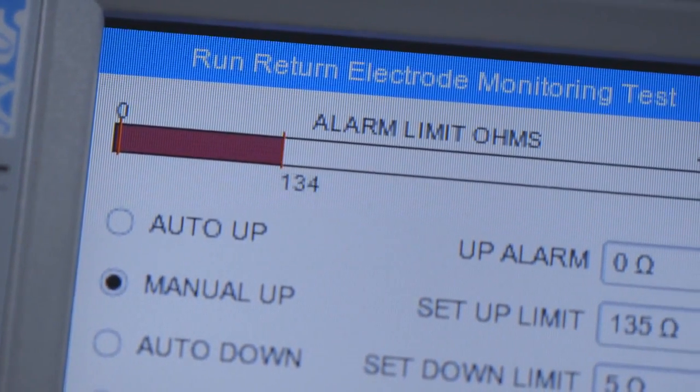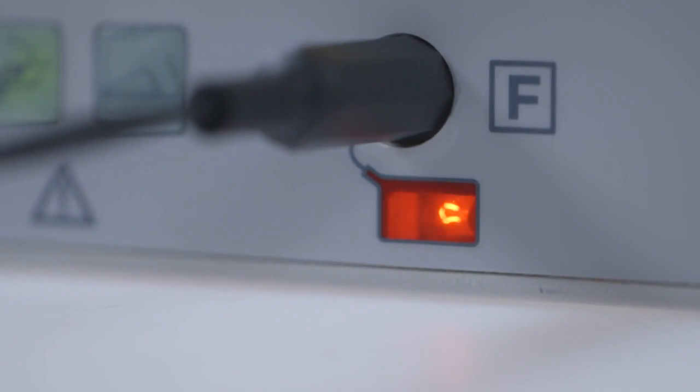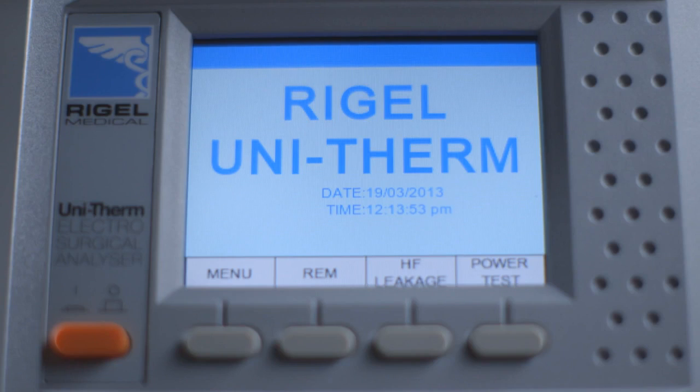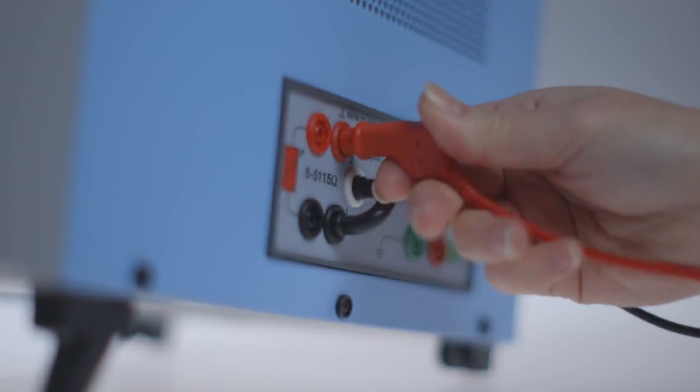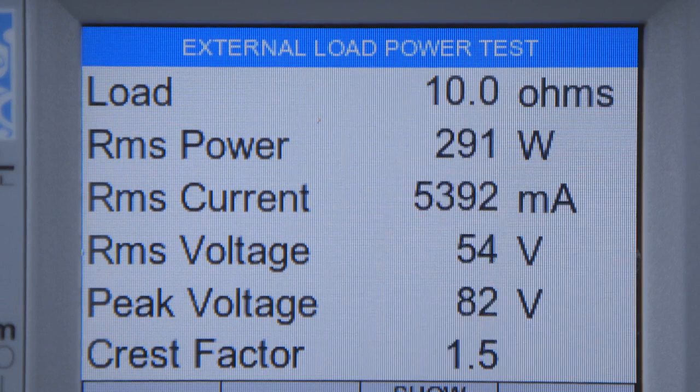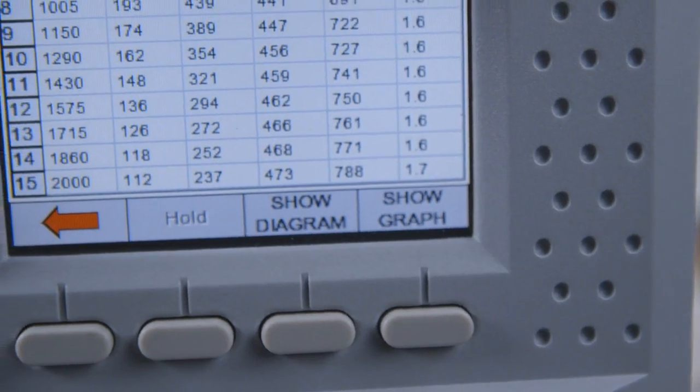This enables the testing of modern contact quality monitoring systems that are triggered by relative changes in resistance. With current measurements of up to 8 amps RMS and featuring an extremely accurate load bank, the UniTherm provides unmatched accuracy even for testing high current vessel sealing treatment functions.